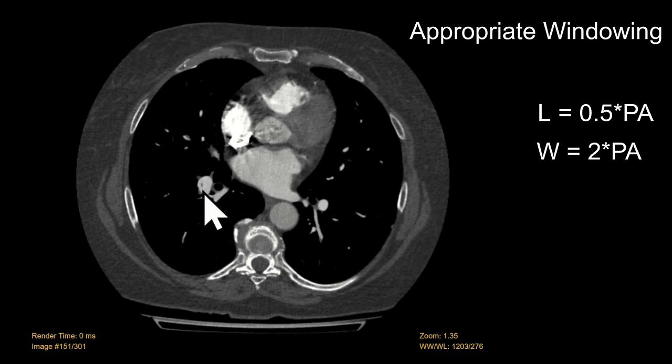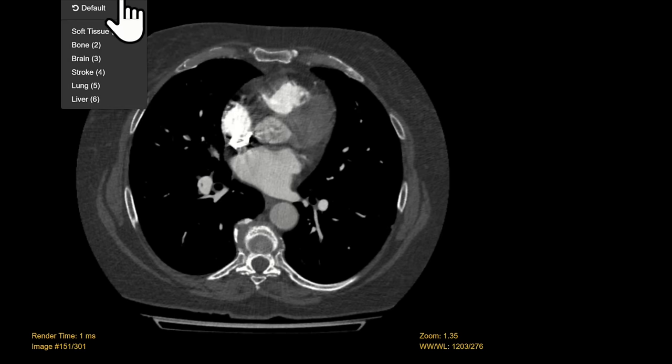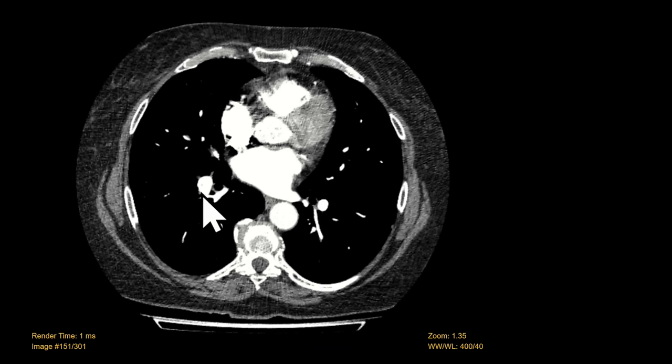Notice the PE here — it's much more apparent than it was when we did not window the study.